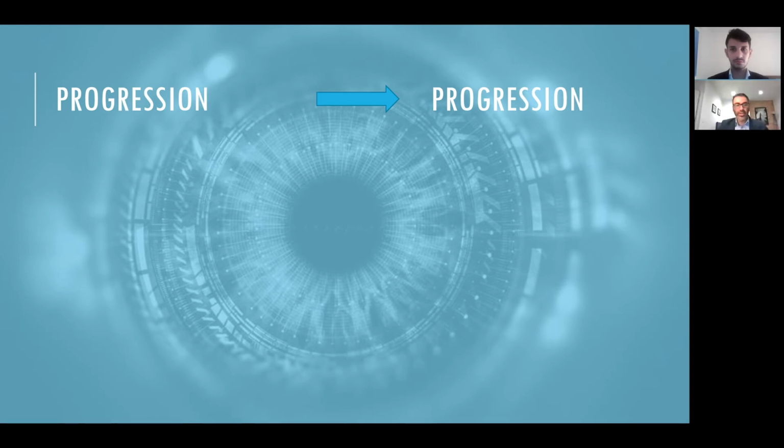So you actually bring up a really good point. Progression, I think that's the real value of the OCT, because we know that glaucoma is a progressive condition. So I think the big benefit is looking at change over time. The examples that you showed were done in a relatively short period of time. We're looking at this event analysis. So let's have longitudinal analysis. Let's look to see if you have a patient who's been under your care for a long period of time.